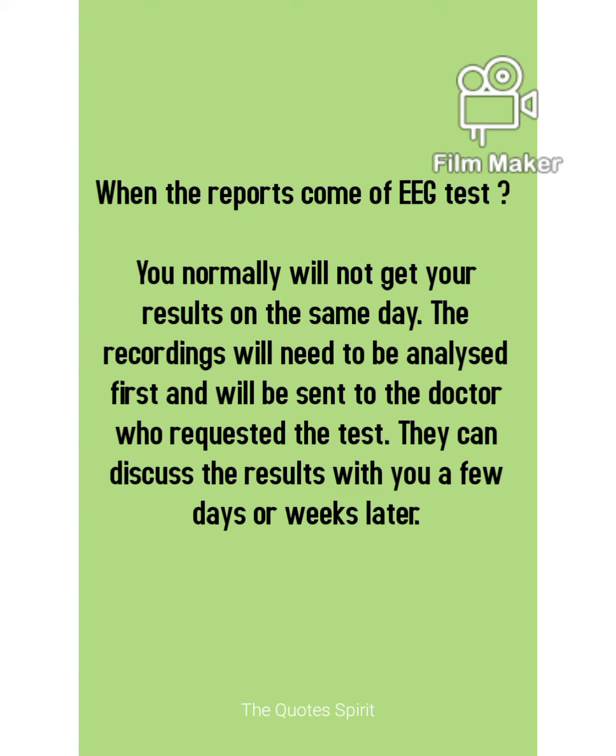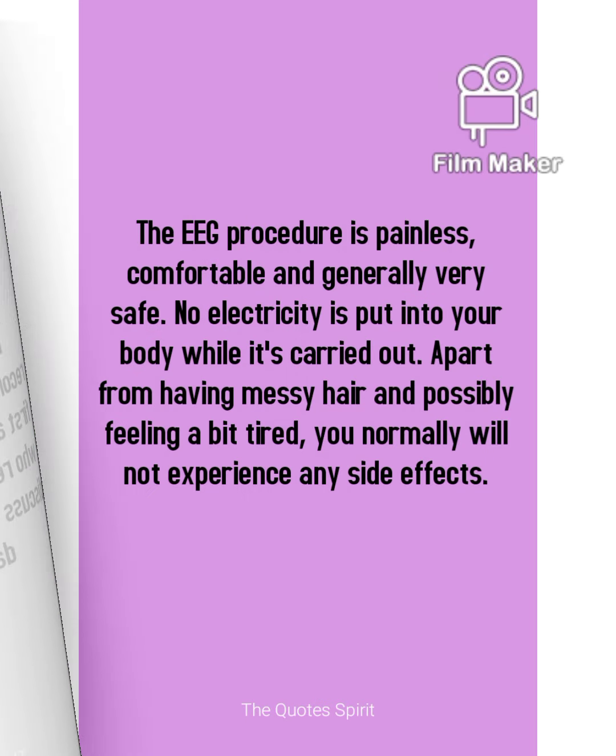Now let's see when the reports of the EEG test come, and how much time it can take to give us the report. You normally will not get your results on the same day. The recordings will need to be analyzed first and will be sent to the doctor who has requested the test, your healthcare provider, psychologist or psychiatrist. They can discuss the results with you after some days, whenever they think it's the right time.